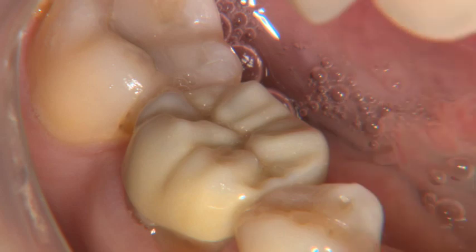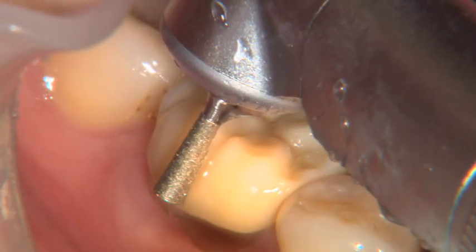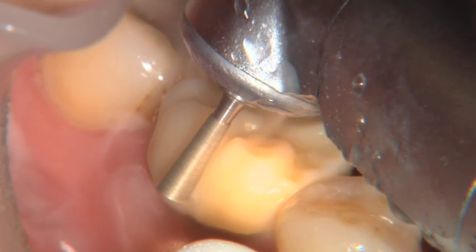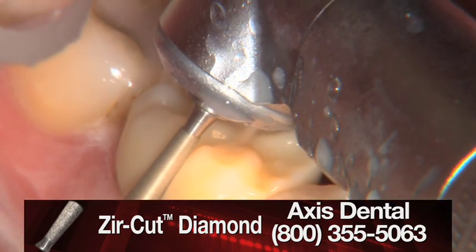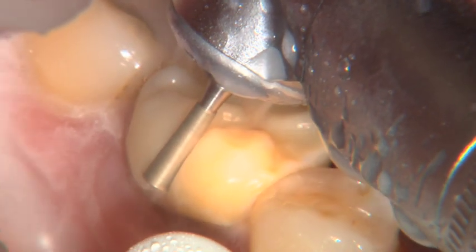One of the most common questions I get about Bruxer is how difficult is it to cut off? And as long as you have the right bur, it's really not difficult at all. I'm going to cut this Bruxer crown off. This is a Zurcut diamond from Axis Dental. It's a very fine grit diamond, which is a little counterintuitive — you would think you need something really coarse to cut through something really tough like zirconia, but that's not true. You need a fine grit.